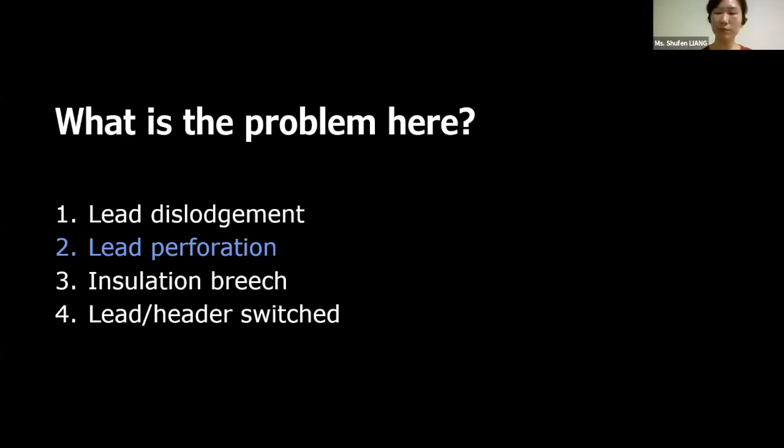Okay. And was diaphragmatic pacing also noticed during the implant or after? After? No, the post check was absolutely normal. Only when she came to the emergency department.